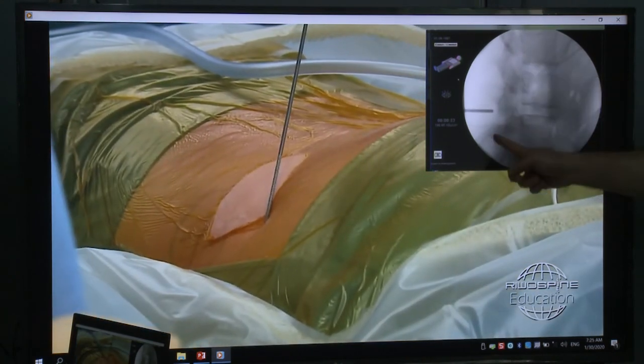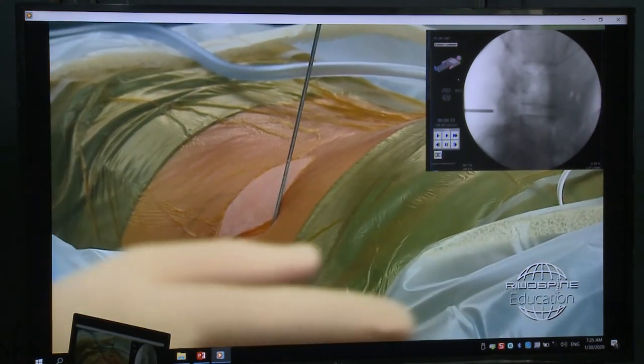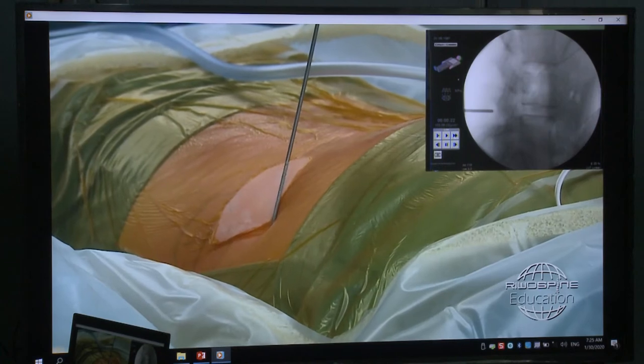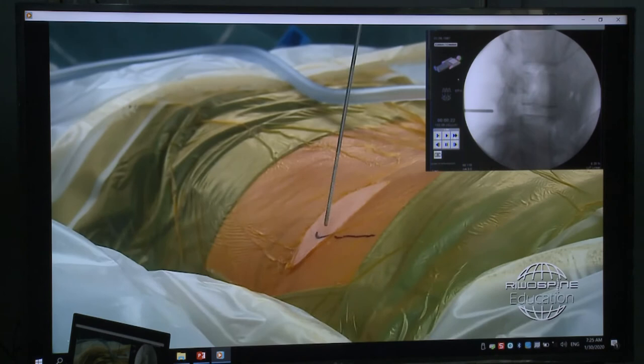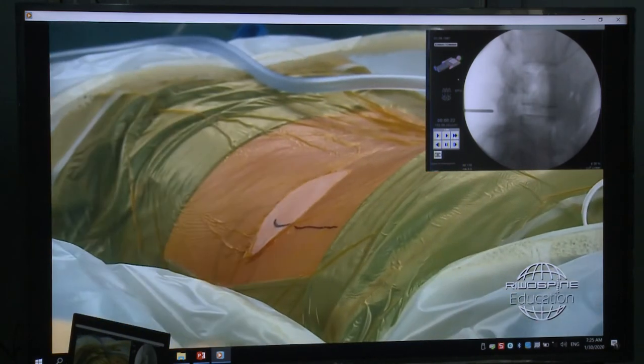The posterior part of the facet joint. There's our first line, the red line. The sequestration is in the midline. That's why we go more lateral.